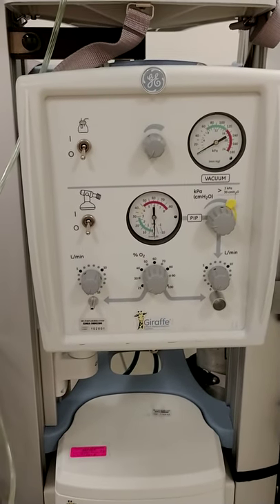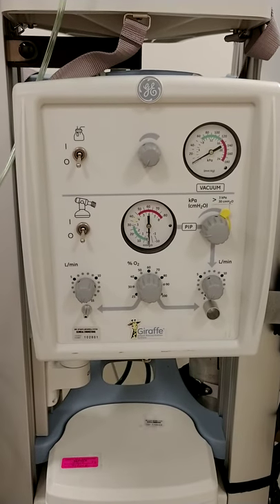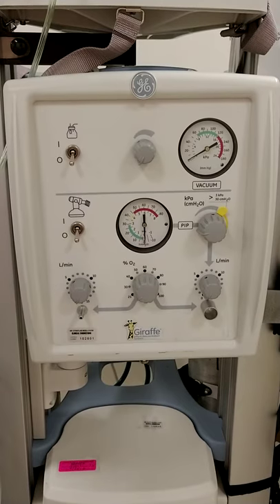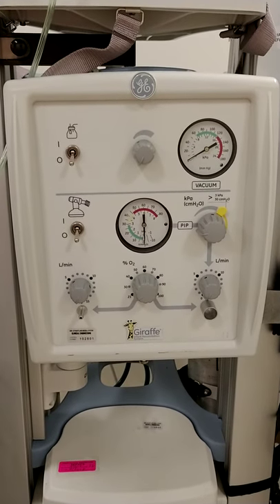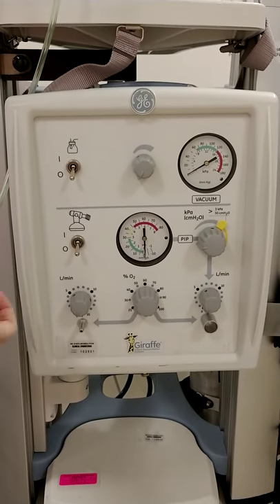Welcome back! Now we're going to discuss how to set up the Ambu bag with our giraffe warmer. The first thing you need to do is to turn on your air and oxygen flow, which is the middle switch on the panel.